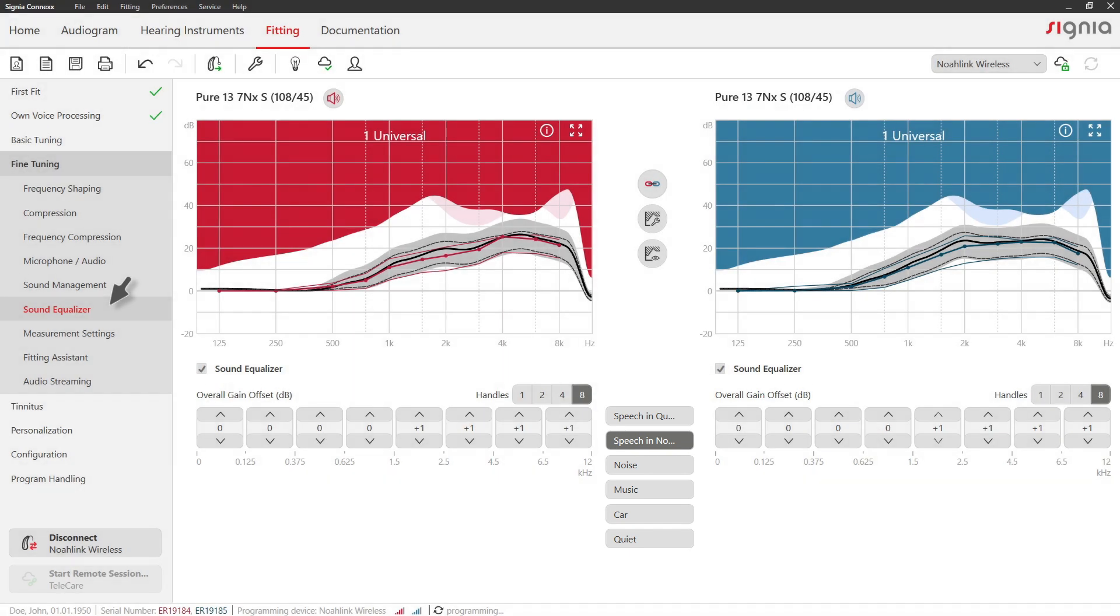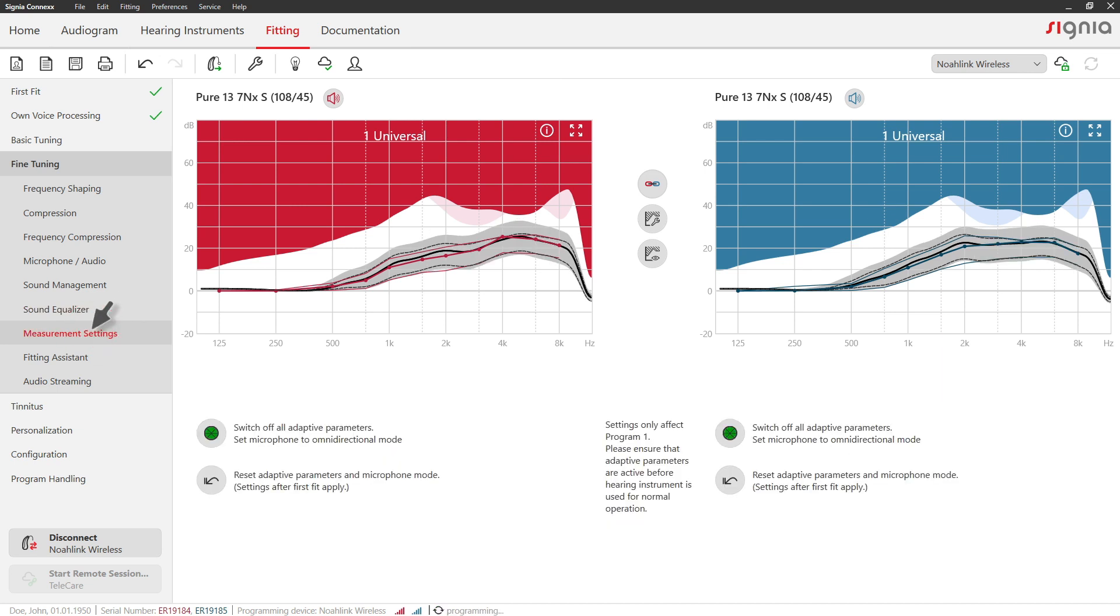Enter the measurement settings tab in case you need to analyze the hearing aids behavior with a test box like Unity.